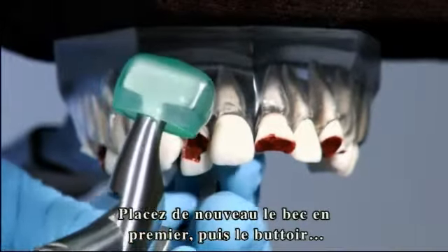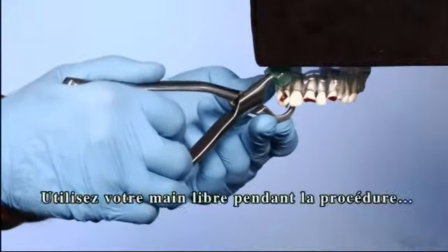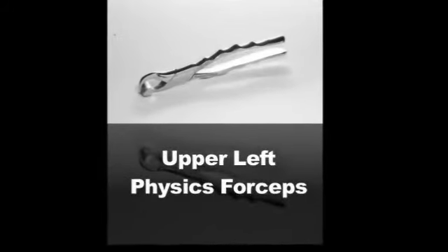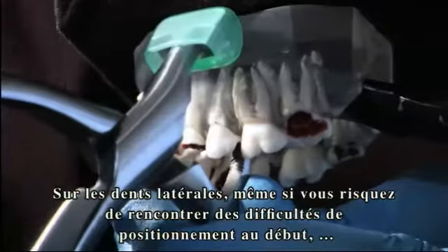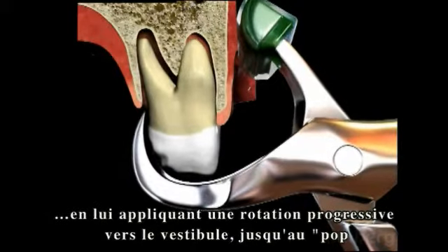Once again, set the beak and then the bumper, using your free hand to help accomplish proper positioning of the instrument. We encourage the use of your free hand during the procedure to maintain stability until the tooth has disengaged. On the contralateral position, this initially may seem slightly awkward at first, but it utilizes the same principle of wrist-only movement. Do not use your arm, and do not squeeze the handles. Simply hold the instrument in position, gradually increasing buccal rotation until you feel the tooth disengage.